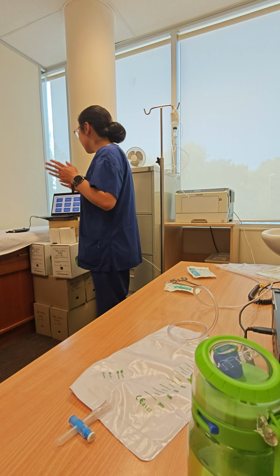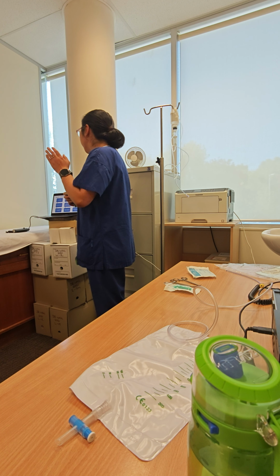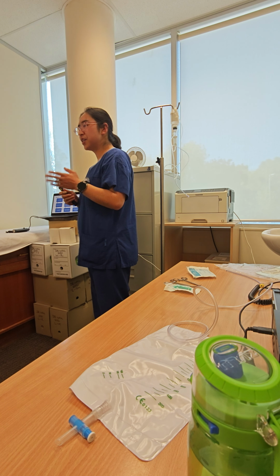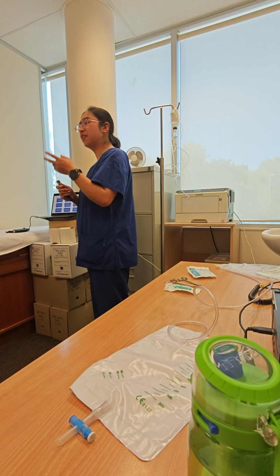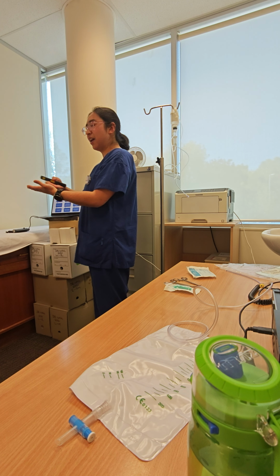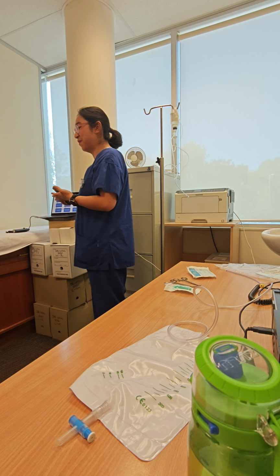All right. That's the second important thing we need to do every time: obtain consent. What consent are we going to need? The first one is the consent about contrast use. Is it safe to use the contrast for this patient? Another one is the consent to proceed with the procedure. So every time they have a contrast consent form.